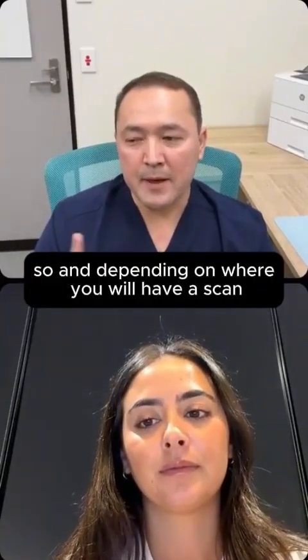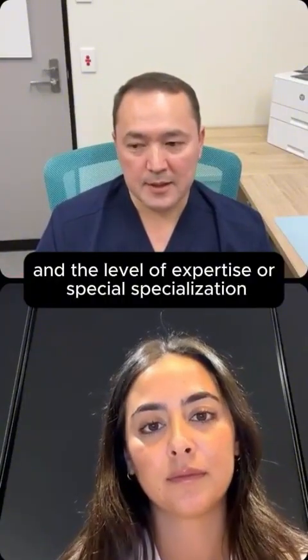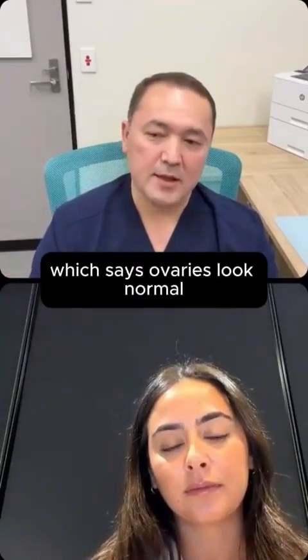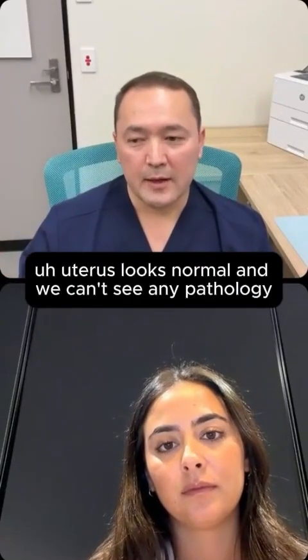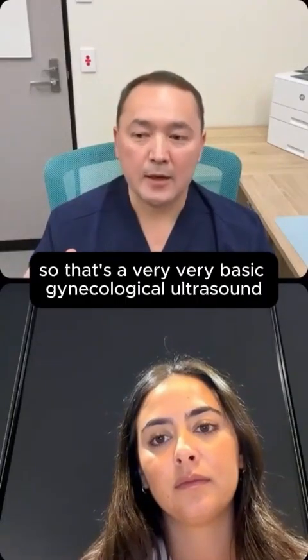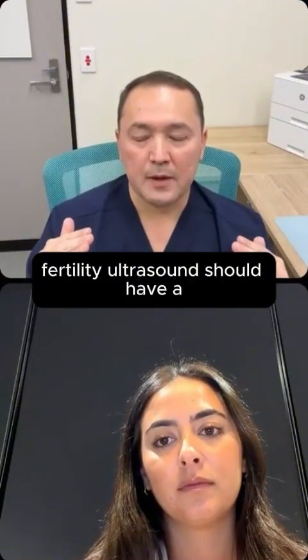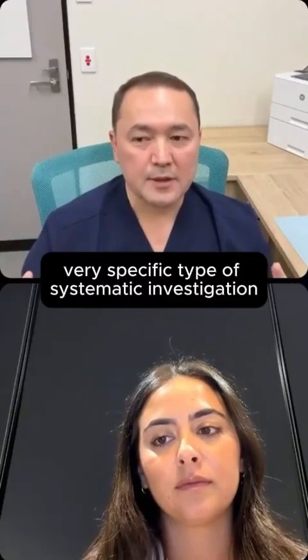Depending on where you have a scan and the level of expertise or specialization, you may just end up having a simple gynecological ultrasound scan, which says ovaries look normal, uterus looks normal, we can't see any pathology. That's a very, very basic gynecological ultrasound. It's not a fertility ultrasound. A fertility ultrasound should have a very specific type of systematic investigation.